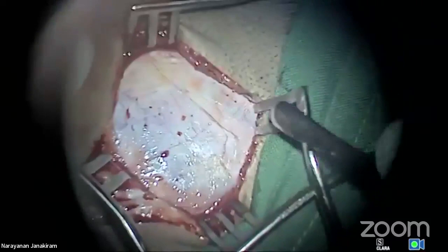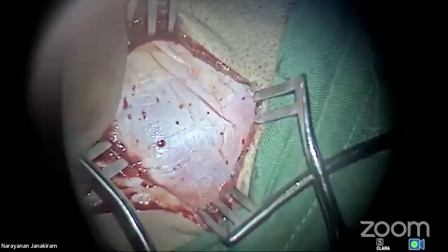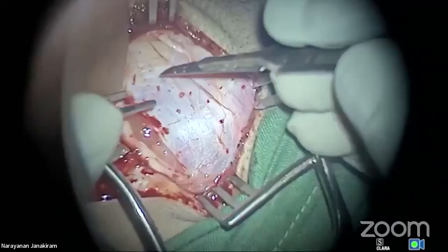Now, infiltration. Okay, that is the fascia. You see, fat is always there. So in MRM you can take that, but in myringoplasty, I don't take that. See here. Now, see such a big graft. See that. Many people, they just put that retractor and all. To me, I think exposure. See the fat there.